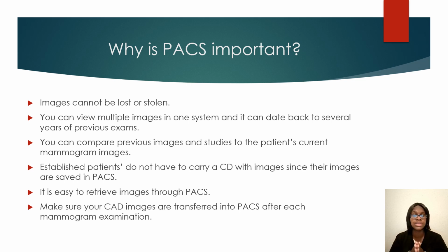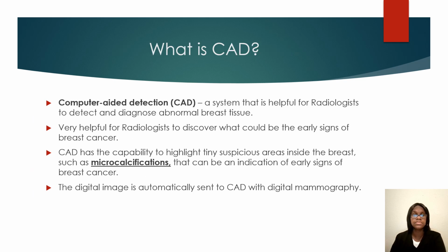You can go ahead and read it. I've done everything. So make sure that you have those CAD images in PACS as well.